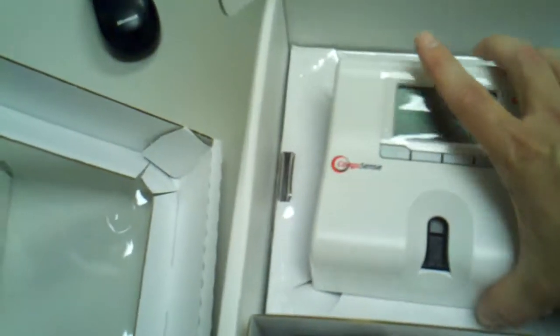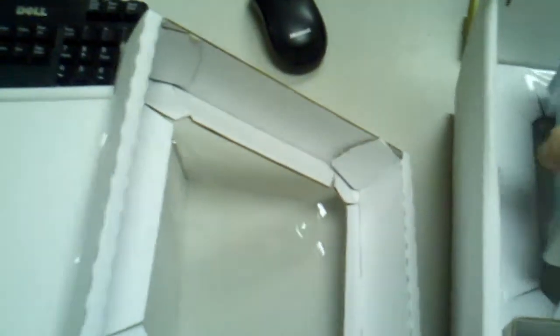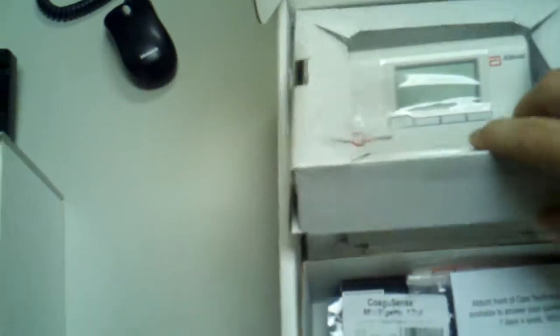And this is how the meter comes. It's very light. It's about maybe a pound. This is how it looks, people.